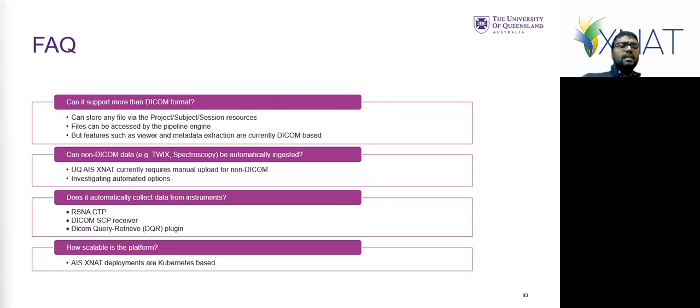There is another plugin called the DICOM DQR plugin. It's not something we use, but if you're interested, that's maybe something you want to look at for automated DICOM transfer, because it's designed to talk to PACS systems and get data across.